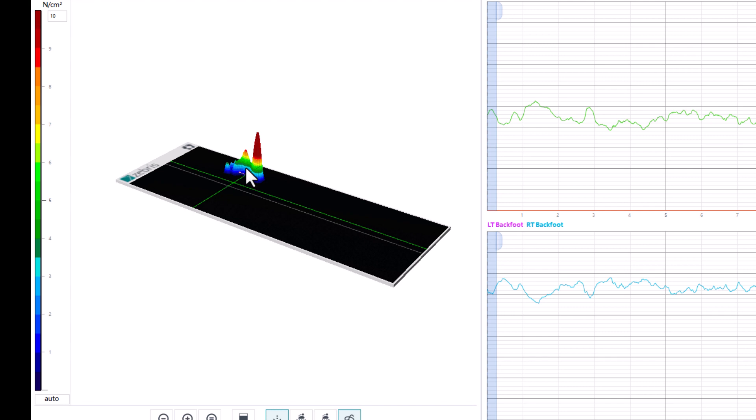Optionally, the pressure scale can be adjusted individually in each measurement. Changing the pressure scale causes a proportional change of the display's pressure height in the 3D image. It does not change the measurement data, only the depiction. To see this well, in the following we always look at this footprint.